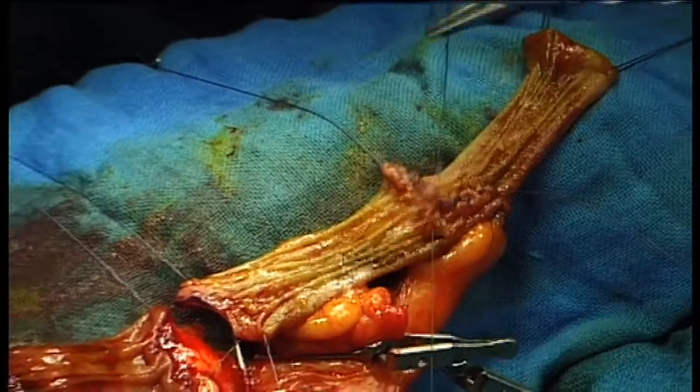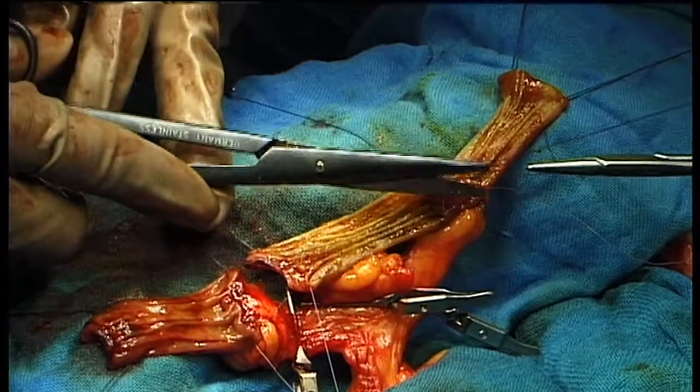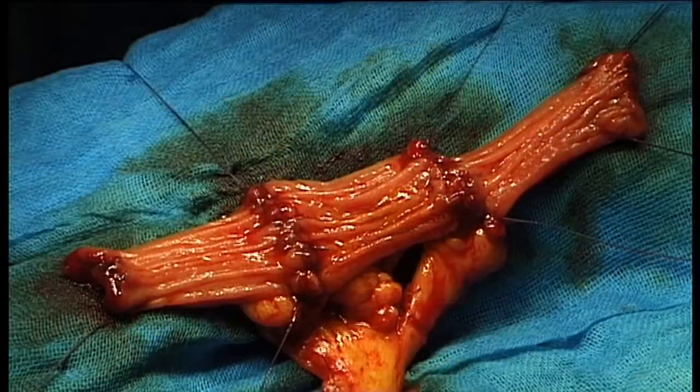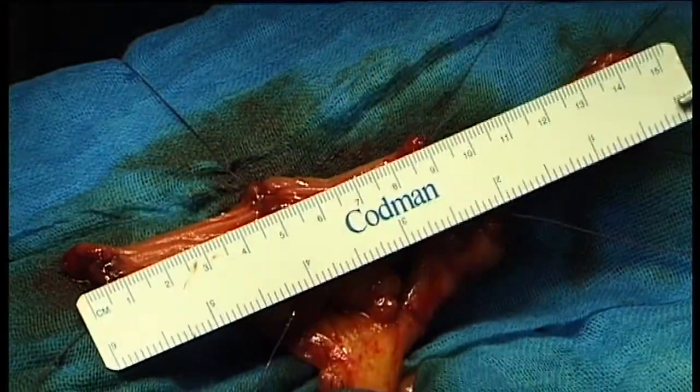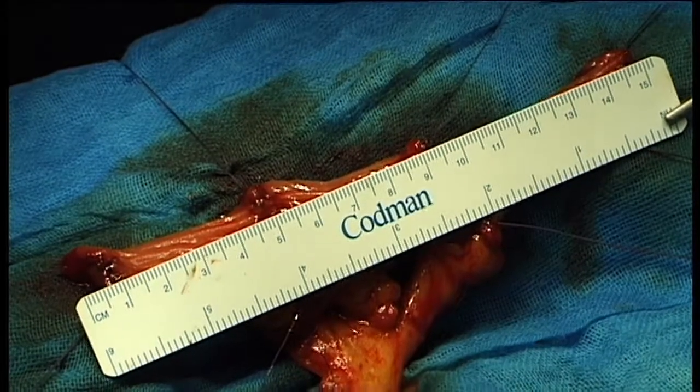The three ileal strips are sutured to one another using 4-0 Vicryl interrupted sutures. As a result, a single ileal strip approximately 18 centimeters in length is formed.